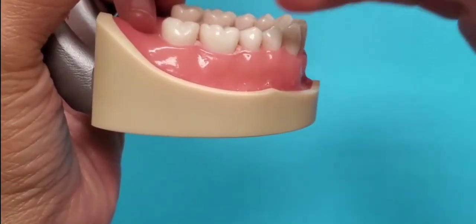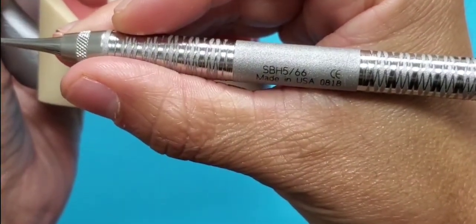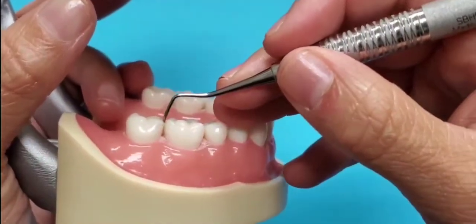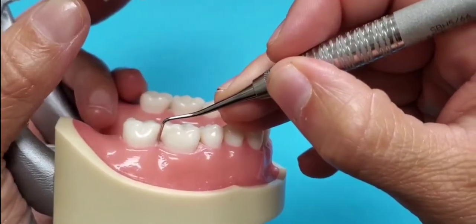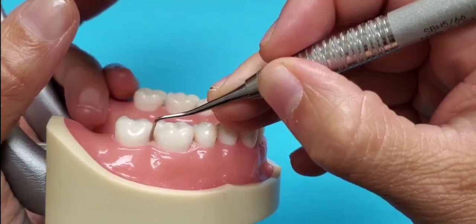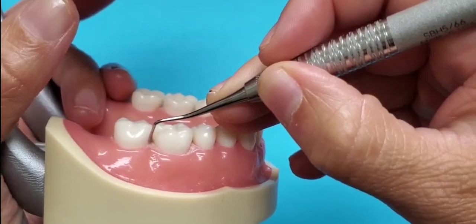Looking at how to find the correct working end for the Barnhart 5-6 instrument in the posterior regions. The best way to do this is to fulcrum on a premolar, place the instrument interproximal in the molar area, and pay attention to the lower shank. The lower shank should be parallel to the long axis of the tooth. You can also say that the functional shank should go up and over the tooth.